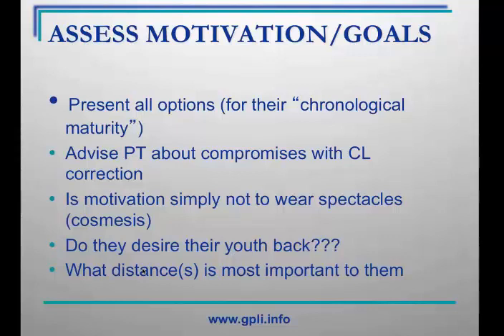Is the motivation simply not to wear glasses? That's a tremendous motivator. And that's definitely a great success rate for patients who have been single vision contact lens wearers. As a GP multifocal wearer myself, I love going into a restaurant and having dinner with my friends, all of whom are wearing glasses, and simultaneously ordering dinner off the menu, and then looking at the expression on their face, which seems to say, gray hair, Ed has to be one of us.